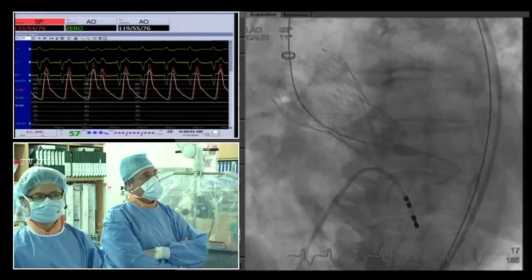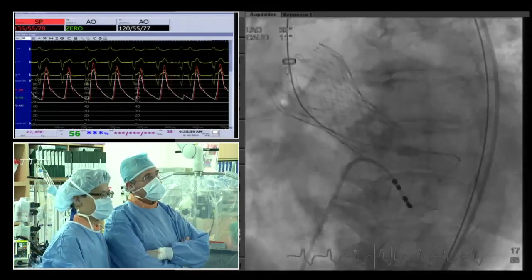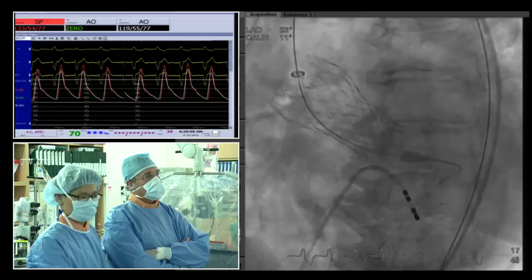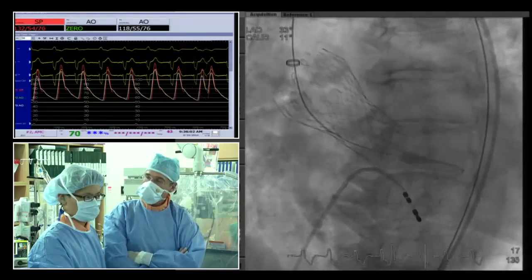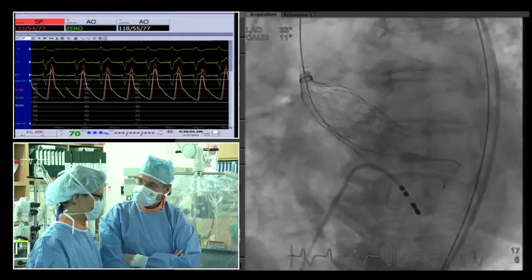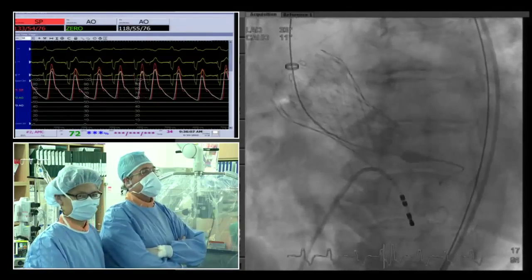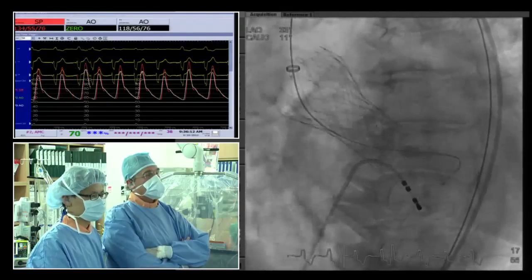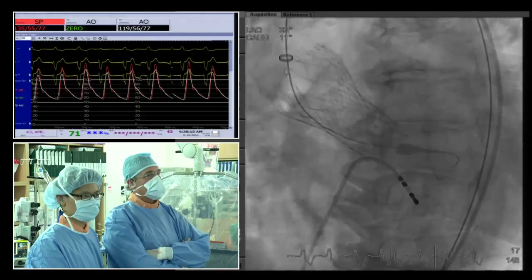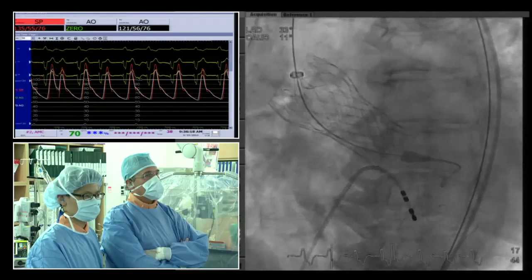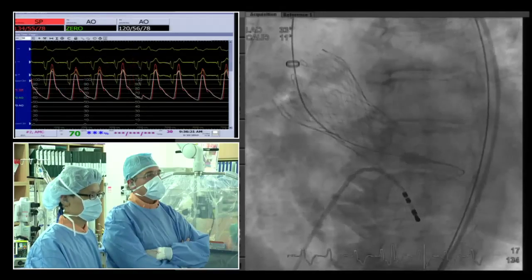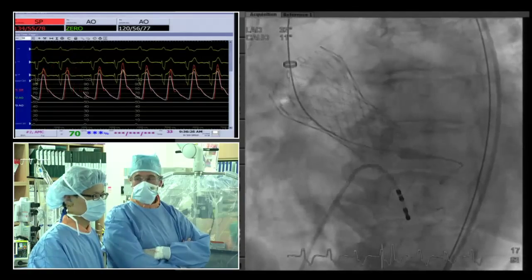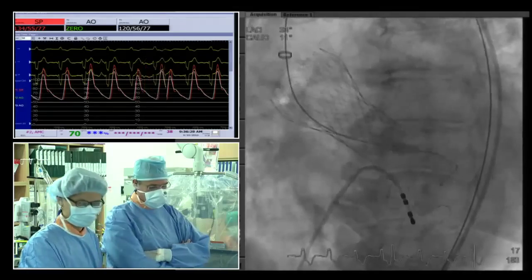Sometimes releasing the hooks can be technically challenging — patience is required. With approximately 10 minutes remaining, the session wraps up. Dr. Kim is acknowledged as an excellent collaborator. The result is described as a brilliant demonstration of a controlled CoreValve procedure, with Dr. Kim's deployment technique and Dr. Laborde's stabilization both contributing to the excellent outcome.